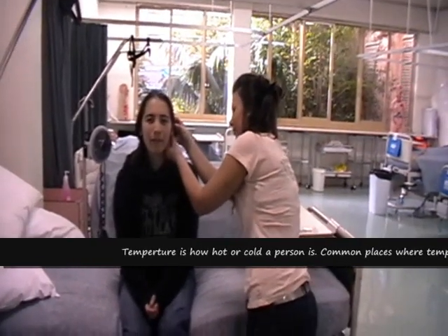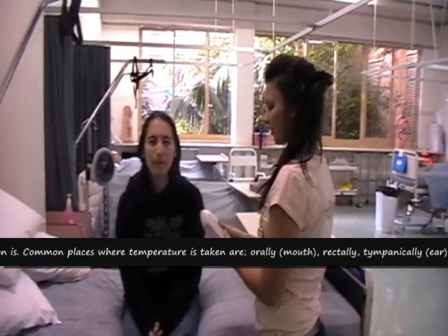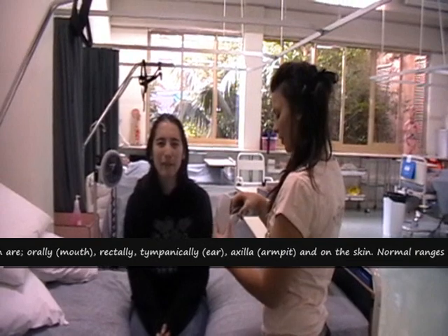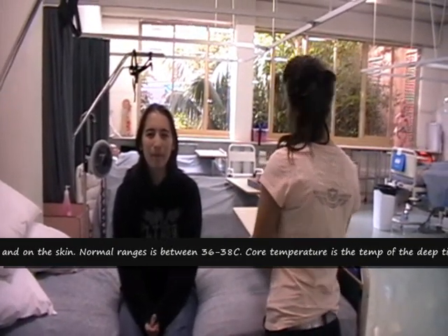Temperature. How to take temperature tympanically. Explain the procedure to the patient and inspect the ear canal for a clear view of the tympanic membrane. Remove the thermometer from its base unit and set the head of the thermometer into the probe cover.